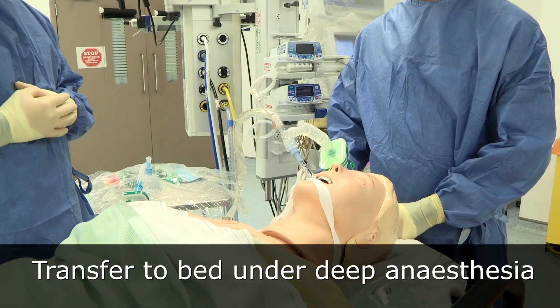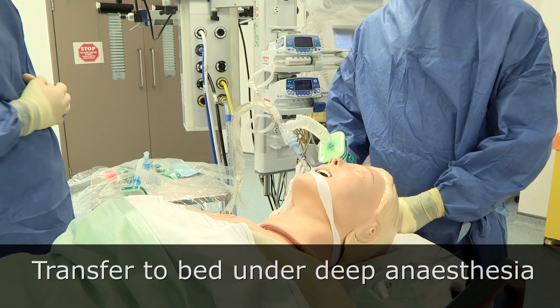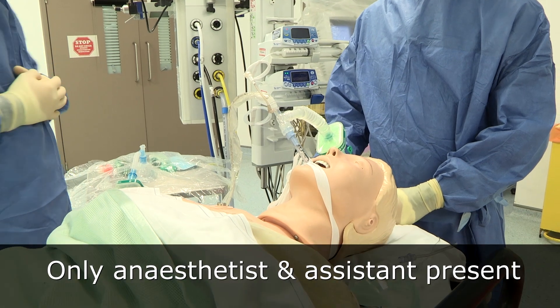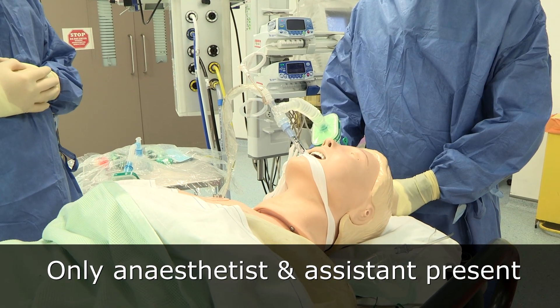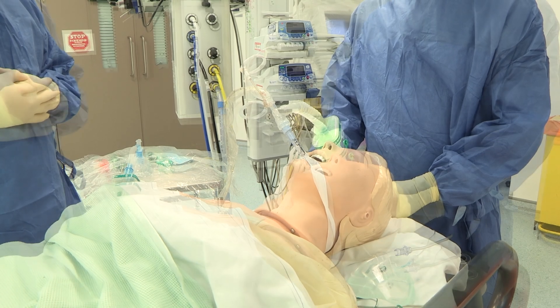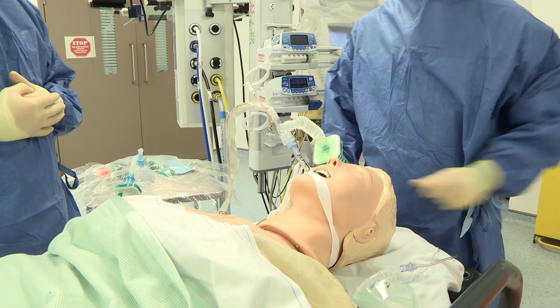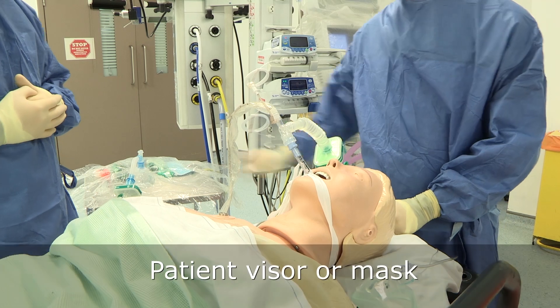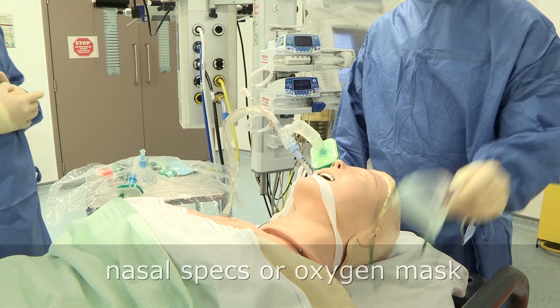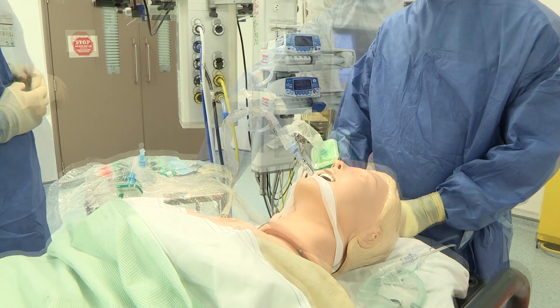Transfer the patient to the bed under deep anaesthesia. Only the anaesthetist and assistant remain in the theatre — all other staff must leave. Have a waste bin ready, and a visor or mask for the patient. Have nasal cannulae or an oxygen mask ready.